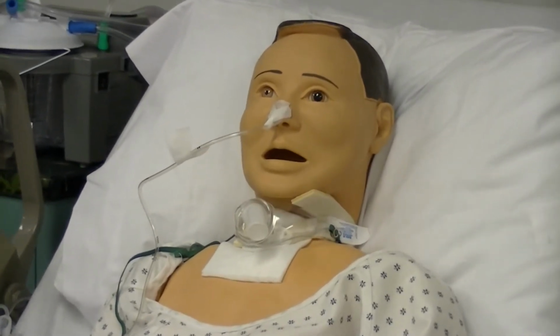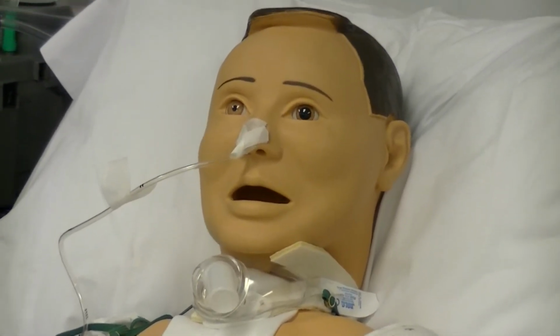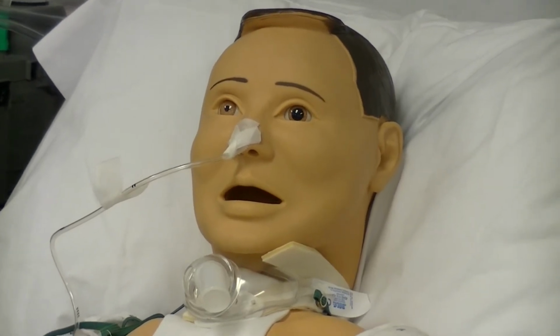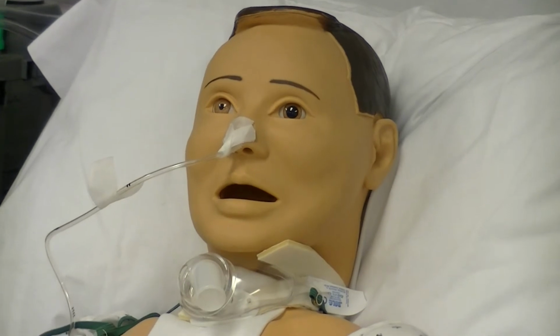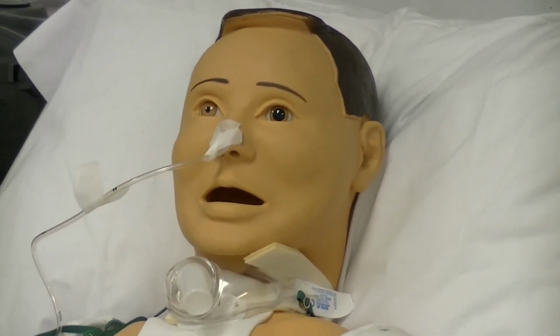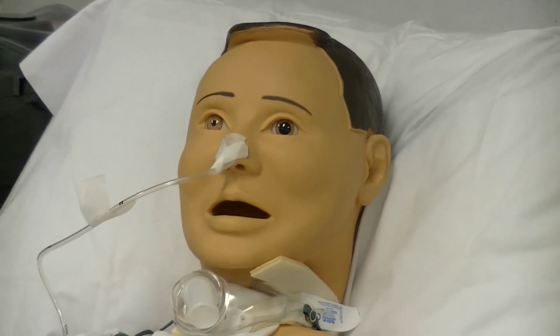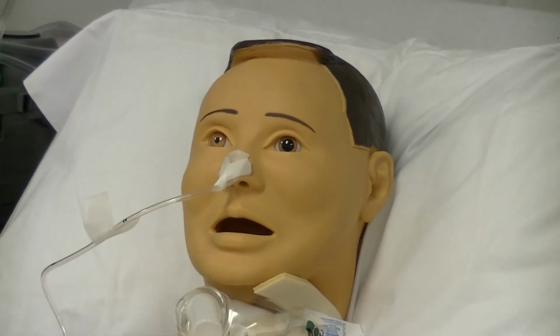And we always want to document. You need to document why the procedure was necessary, the tube length and size and time it was inserted, which naris was used, the patient's tolerance to the procedure, which Mr. Jones did wonderfully, and confirmation of tube placement, which would be the reading of your x-ray. This concludes our demo.